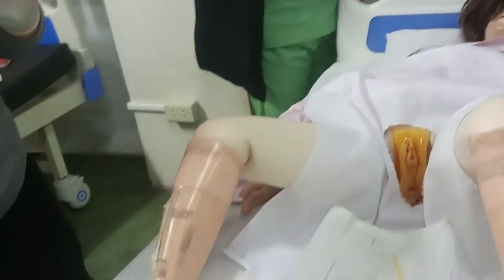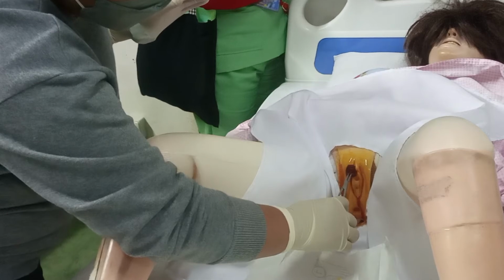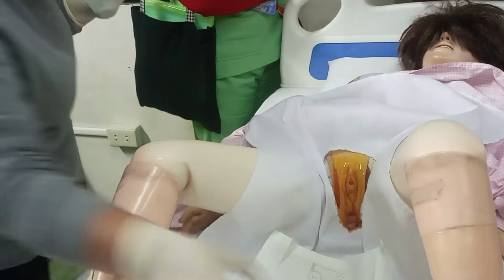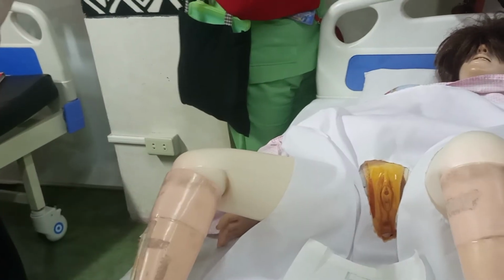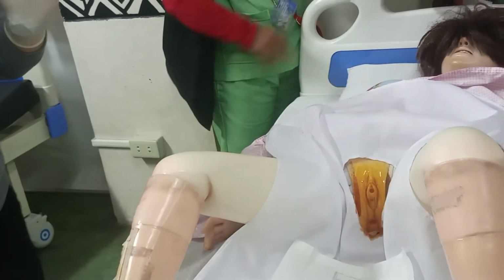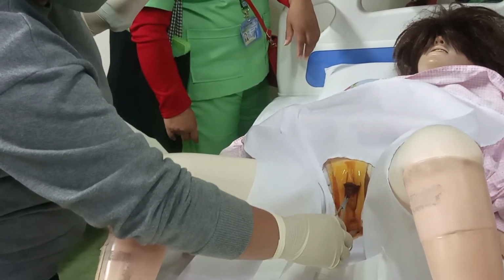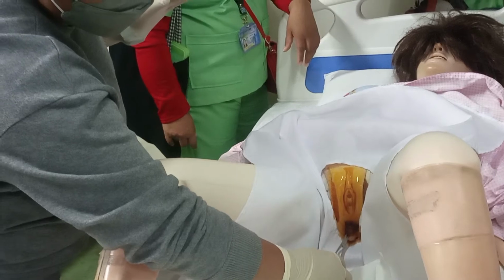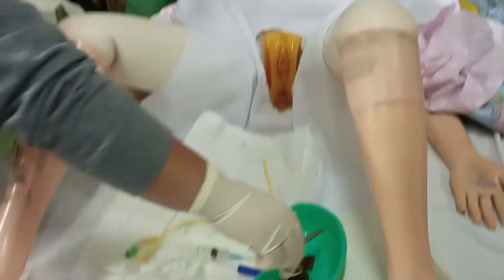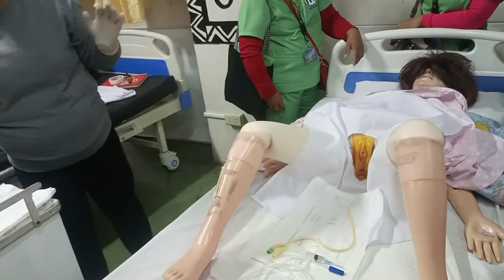Huwag puro hemorrhoid pasyente. Then, from mons pubis, down to labia minora, down to the perineum muscle, down to the sacrum, discard. Then last, from mons pubis to the clitoris, to the urethra, to the vagina, to the perineum muscle, to the anus, discard. Okay? So, since I am done with that one, pwede ko na siyang tanggalin from that area.